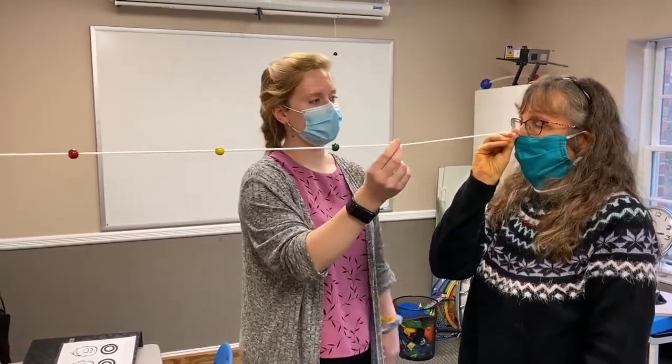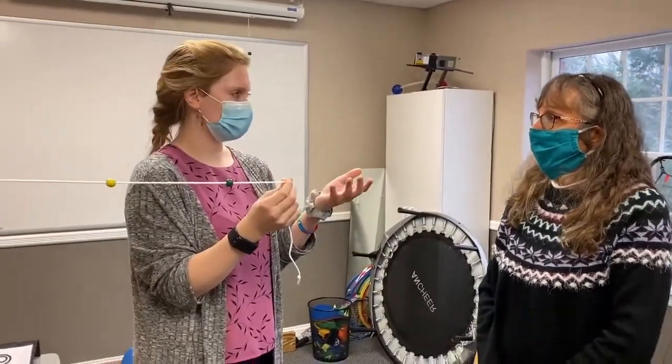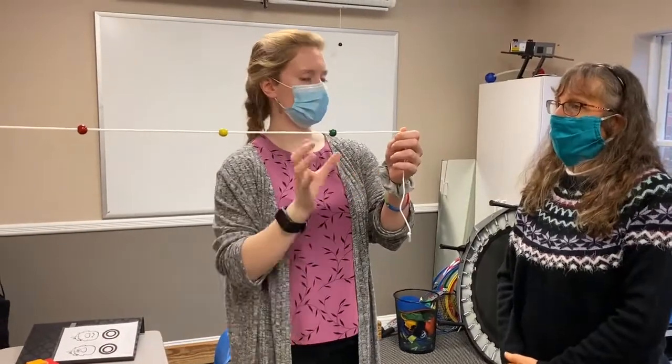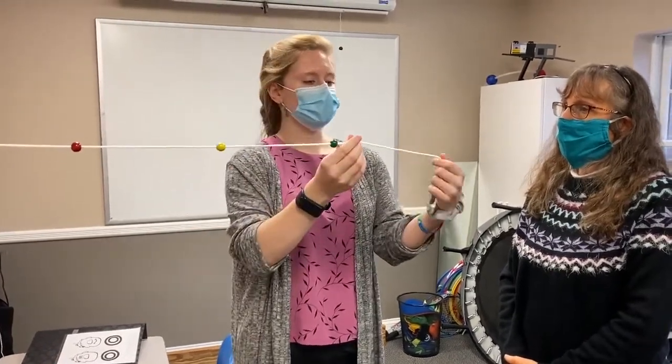What you just experienced is called physiological diplopia, and that's what you should be seeing. Whenever you're looking at the green bead, that's your specific target — everything in that area will be single, but everything outside of it will be double.